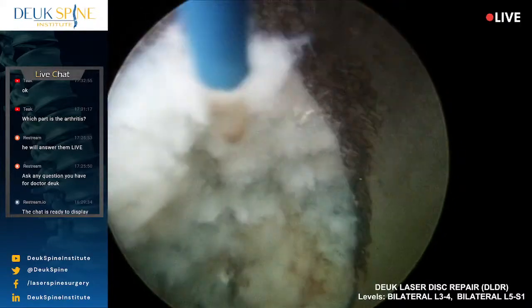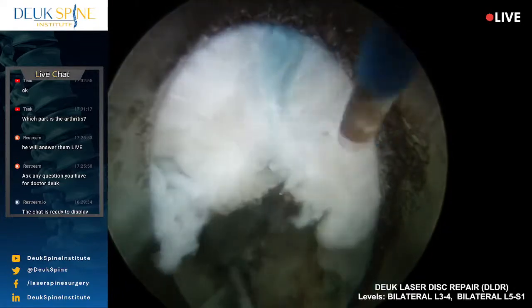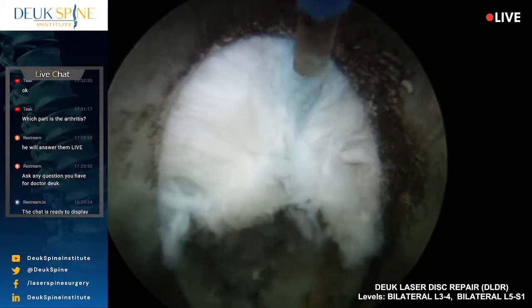So why did you go to France to train? Because I wanted to see what it was like outside of the United States. Oh, let me just say something real quick. That's the annular tear right there. You can see it. All right, sorry.